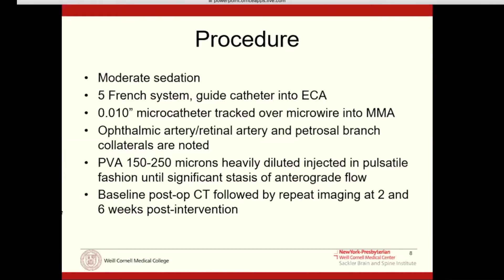The procedure itself is quite straightforward from the standpoint of endovascular. We're using our most minimally invasive size guide wires, guide catheters, and micro catheters. Essentially what we do is we go into the MMA, which is a branch off the external carotid artery. We ensure that there are no collateral vessels to the ophthalmic artery or to the petrosal branch, which can supply cranial nerve seven.